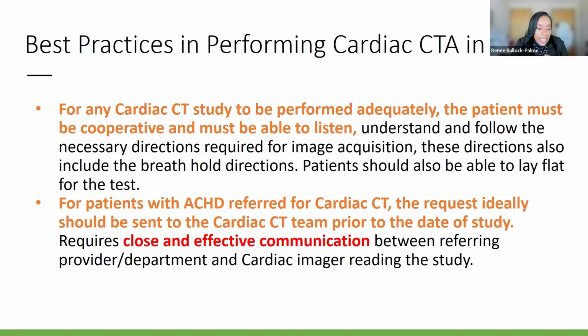Usually the performing of the scan starts before the day of the study, because you want to gather as much information as you can on the patients, such as prior tests that were done, even if they were done at another institution, prior procedures, surgeries, and really knowing what you're looking for at the time that you're doing the study, and having effective communication. It's a village that it takes to take care of these patients. And even as an imager, communicating with the referring provider, the technologist that's performing the scan, and sometimes even the surgeon that you might be referring the patient to.